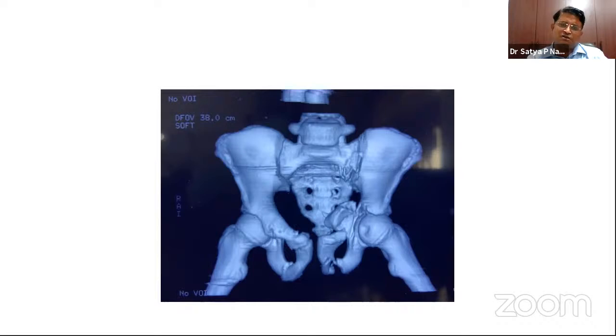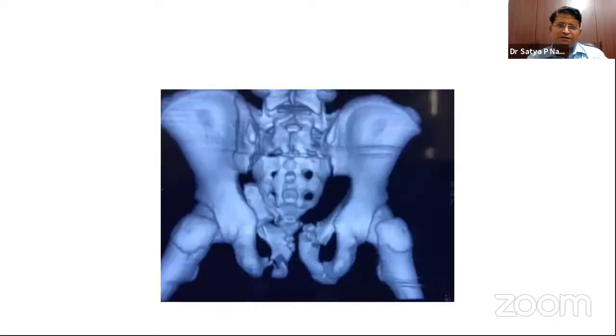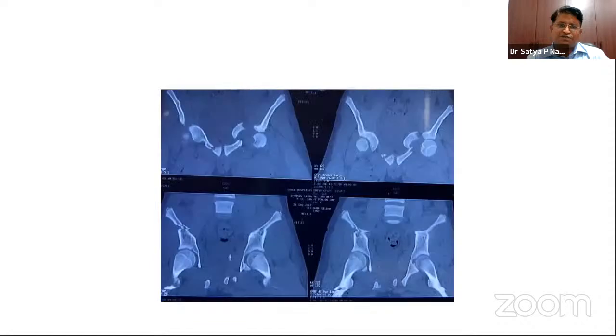It's 26th August 2018. This is a CT. The anterior wall is open. And before that, the patient was not stable, not at all. The anesthetists didn't give any clearance for the surgery. And for 3 weeks, I just followed. Again, the leukocyte counts were extremely high.